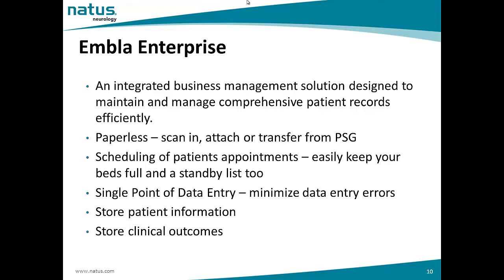What is Embla Enterprise? Basically it is an integrated business management solution designed to maintain and manage comprehensive patient records efficiently. On top of that, I think a lot of hospitals are moving to a paperless system now, whereby you can attach or scan in all your reports from the PSG into the computers. On top of that, you can use Enterprise to schedule your patient's appointment, and this way you can easily keep all your beds full, and you can churn out a standby list as well.